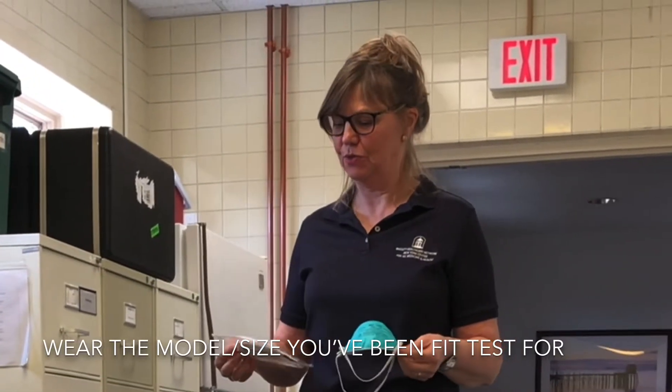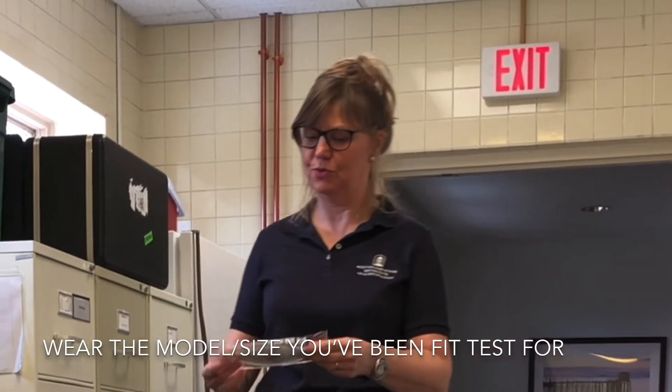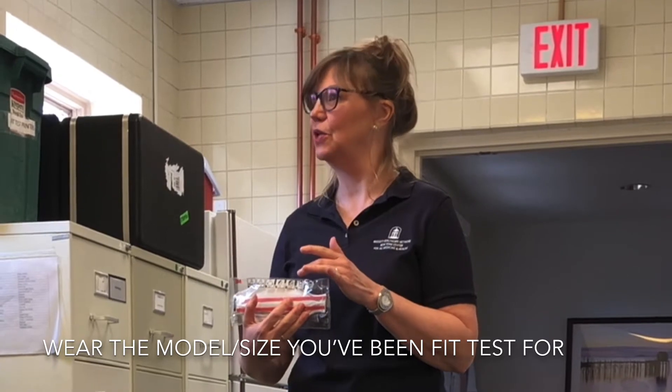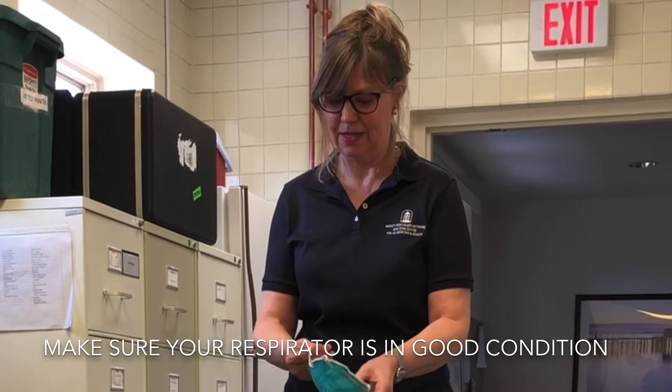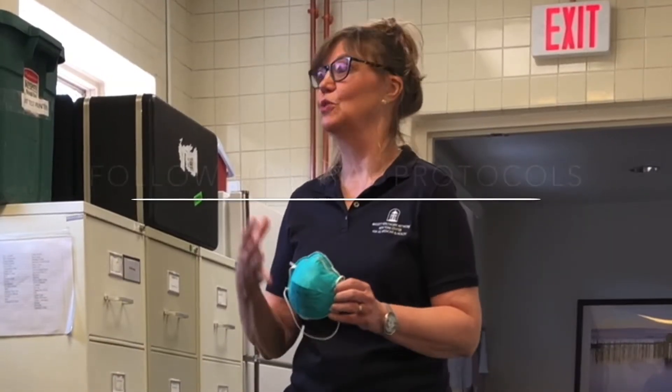Respirators do come in different shapes and sizes. We're going to be looking at these. The important thing to know how to wear it safely is to observe on that respirator itself. You'll see there how to correctly put it on and off, how to do the seal check. You want to make sure that it's all intact, that the elastic straps are in good condition. Generally, these are disposable.